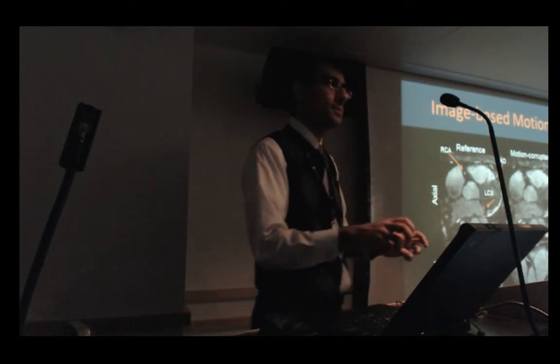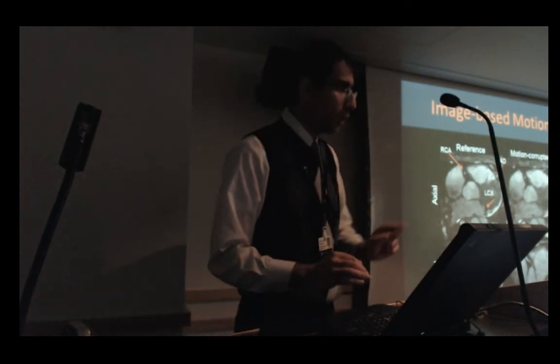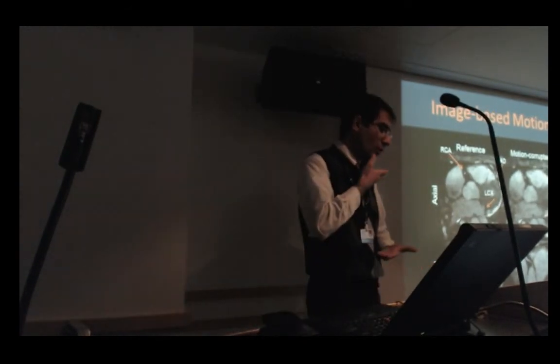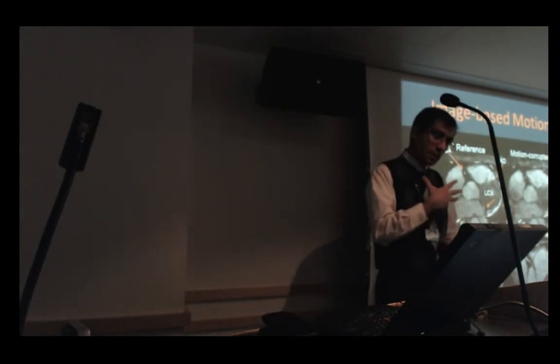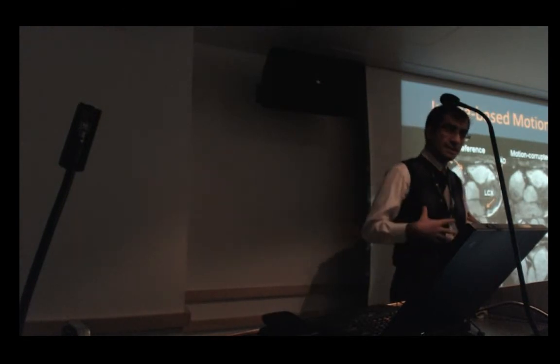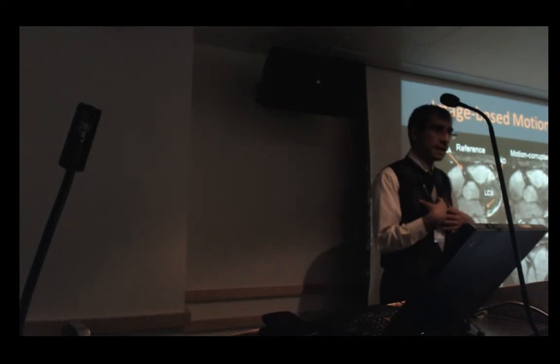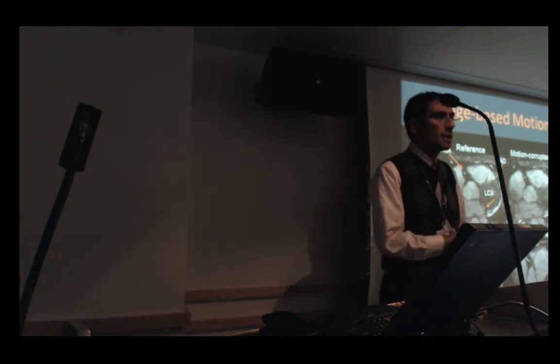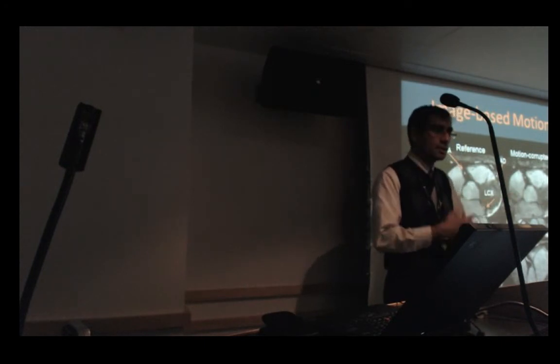Perfect point. Here is one image that we acquired, the reference image, within the 5 millimeter gating window. And then these show you the motion corrupted image when we open up the gating window; there is no respiratory gating, so we acquire the image without prolonging scan time. You can appreciate that the LAD and LCX are totally faded out due to the respiratory motion. And then this is the motion corrected image when we use the sharpness measure as a similarity measure to detect the translation parameters.